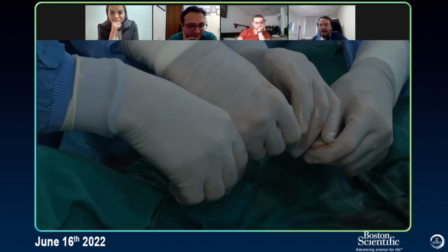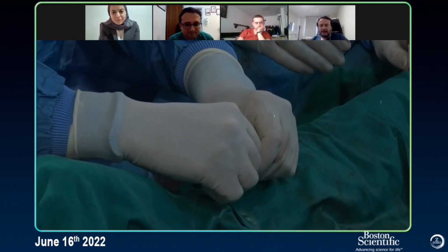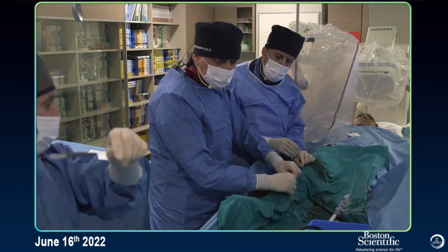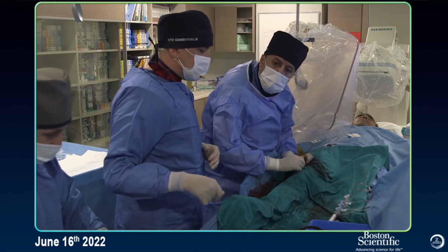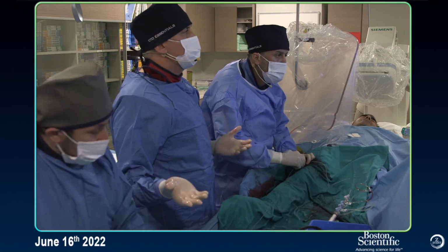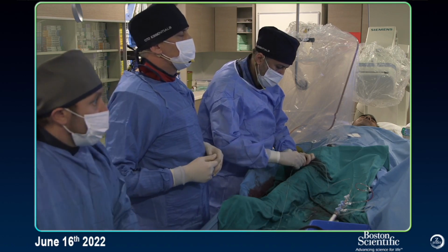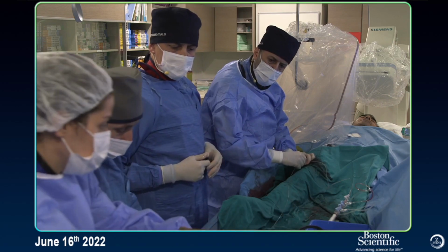Yeah, I know. The wire is very important for the operator. We don't use this rotor wire for the stenting and ballooning, right? We don't use it that much, but other wires, we know everything about them, how much they tire, how we can use them. If we use it, we will use it several times in a month at best. I agree. I just wanted to know whether anyone does it.